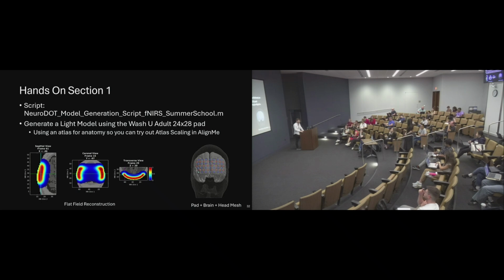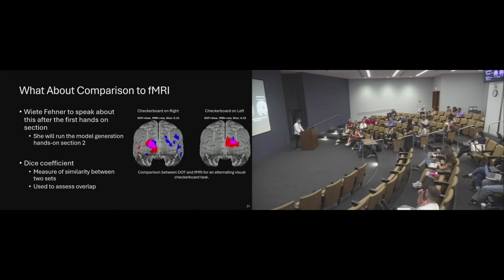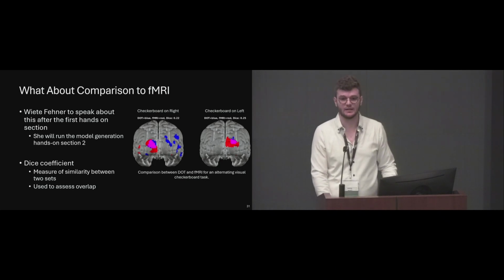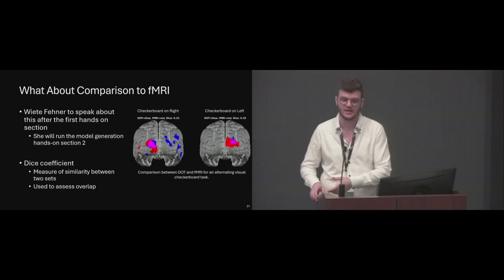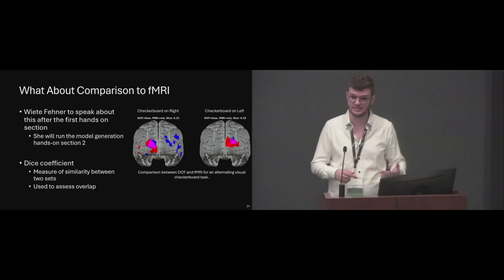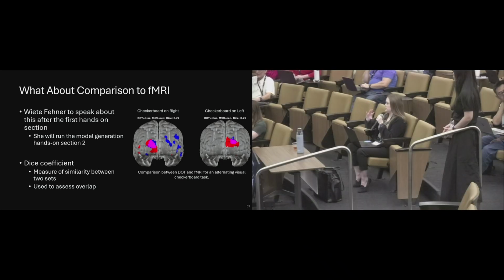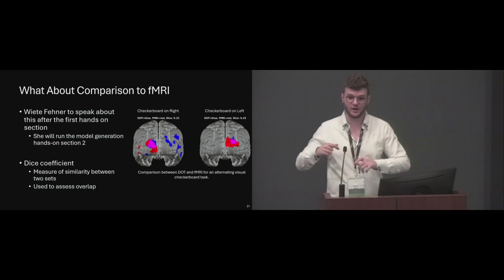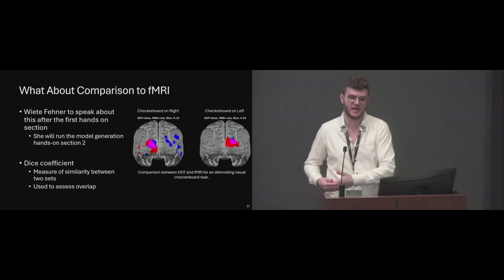Thank you. So I'm better starting with big picture things. Some of the pictures that you showed look similar to what we did in the visualization session last. What is the difference between what we're doing? Totally. So the visualization section was just me highlighting a bunch of visualization functions that NeuroDOT has, which are used at multiple different places within the pipeline. It's not like we're going to use volumetric visualizations only in one specific place. They can be used at multiple steps to visualize the data in different ways. Gotcha. So some of the stuff we learned then we'll be utilizing now? Exactly. What you've learned earlier is like, hey, these are the pieces, these are the functions that I'm going to use, and now this is the application of that into a pipeline.